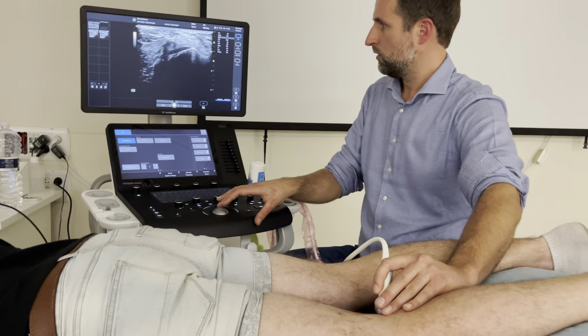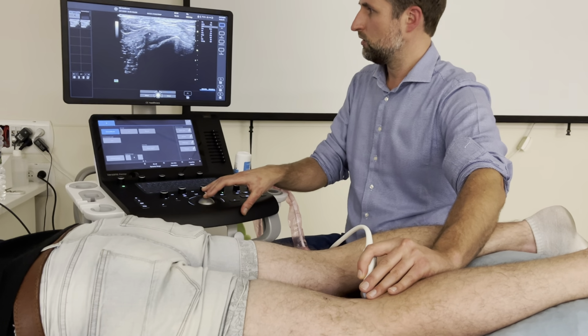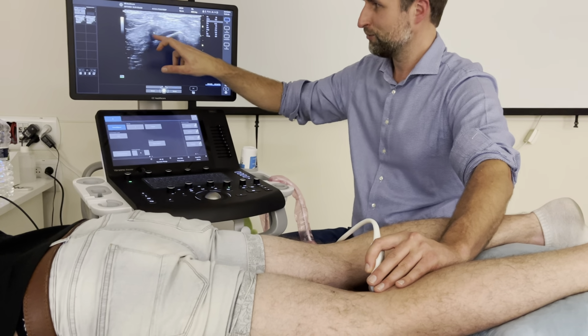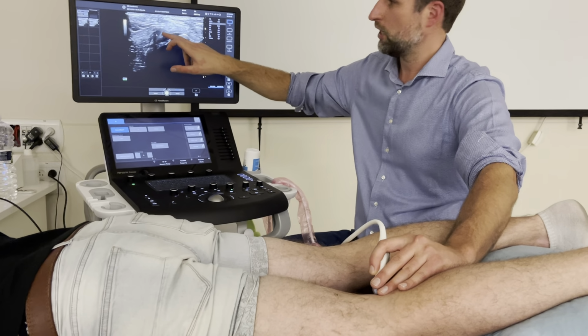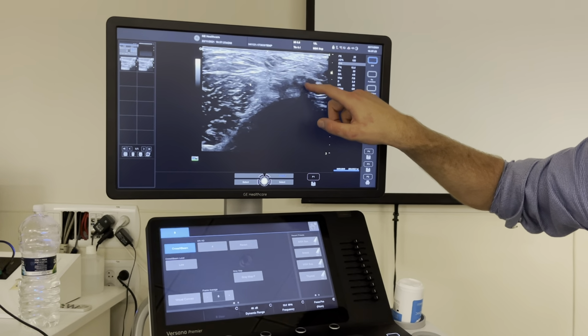First I'm gonna make this tendon hyperreflective. You see here, this is the semimembranosus, and actually when I do that, we see that the comma-shaped or reverse C-shaped tendon of the medial head of the gastrocnemius becomes full of anisotropy. And a lot of inexperienced sonographers actually think that this is fluid inside a bursa, or in a Baker's cyst, and this is not a Baker's cyst. This is anisotropy, because if I angle the probe now, I'm going to angle in that direction. You're going to see that the tendon of the medial head of gastrocnemius will become hyperechoic, and the tendon of the semimembranosus will become hypoechoic or full of anisotropy.